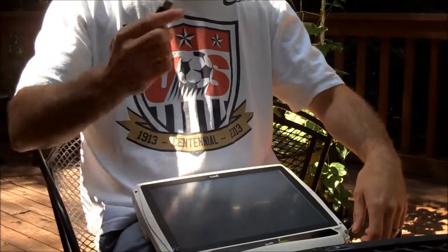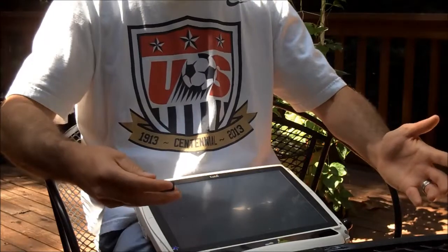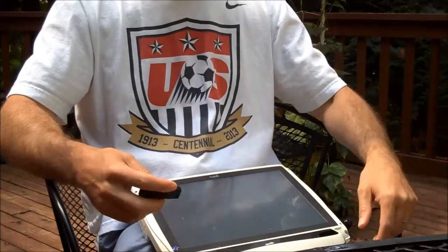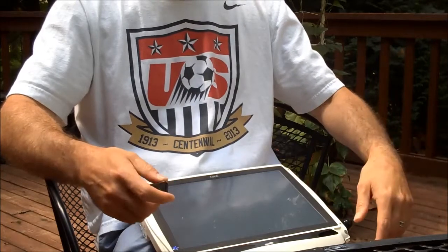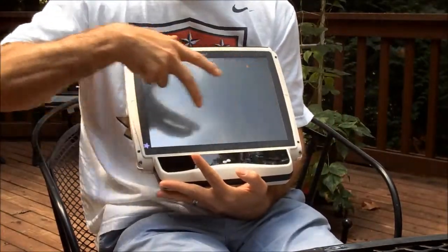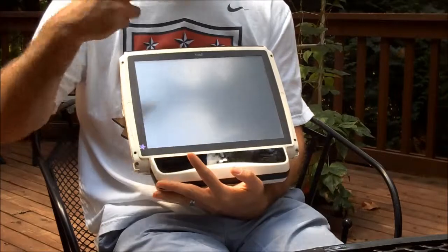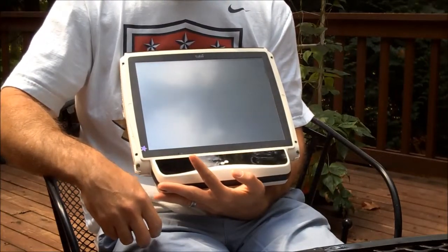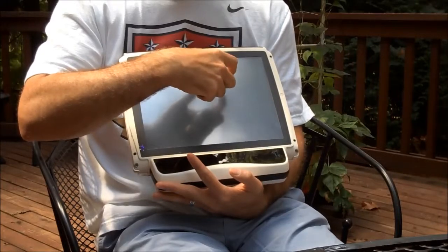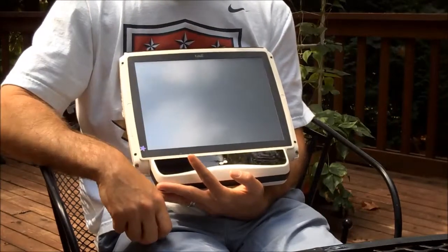And unfortunately, that step of copying it to a thumb drive and then copying it to Jay's device sounds relatively simple. But in the hecticness of day-to-day life, sometimes I'd have changes and I'd forget to do it that day. And then next thing you know, a week goes by and I haven't put changes on Jay's device. Or the other problem I'd run into is my laptop has a different screen setup, more of a widescreen setup. So I would develop pages on my laptop, they'd look great, and then I'd transfer them over to Jay's device, and they wouldn't look good because the buttons I drew had a different aspect ratio. So I'd have to make edits and changes again, and it started to get a little frustrating.